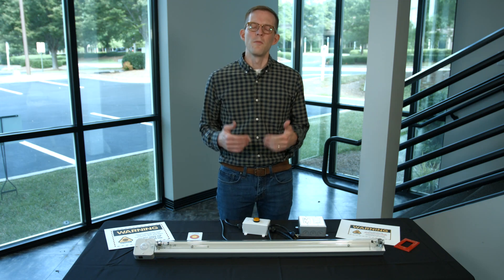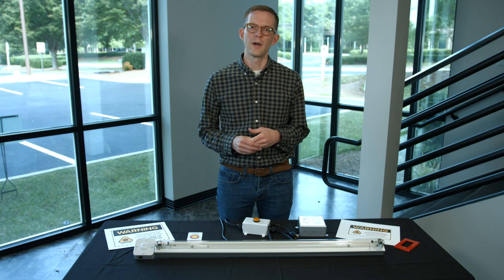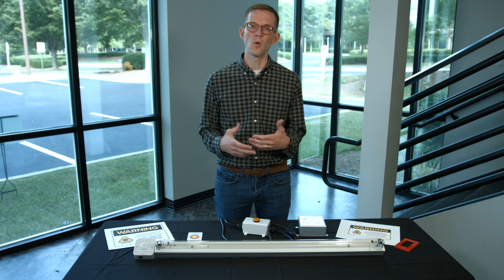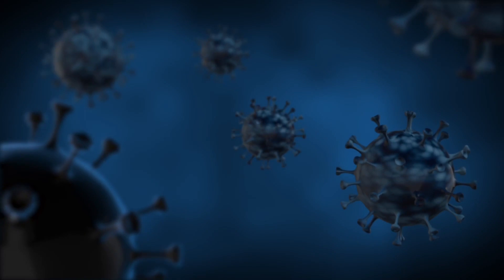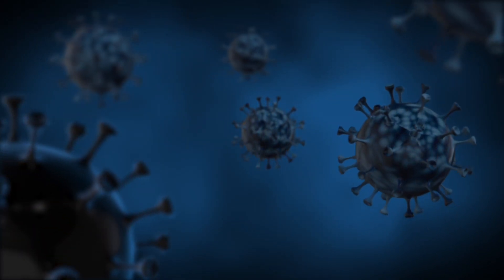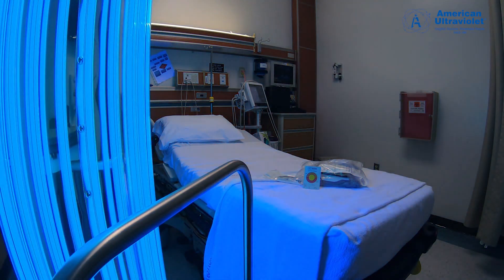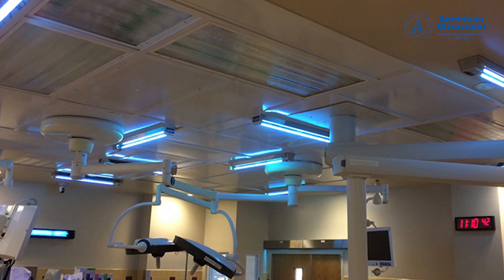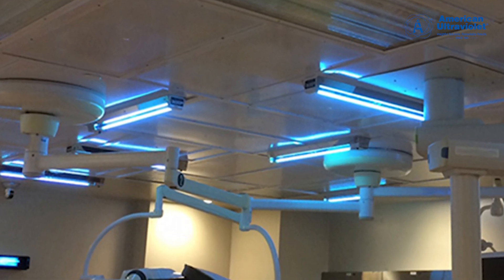Today I'd like to talk about best practices for safely using germicidal ultraviolet light to disinfect spaces or surfaces. This is a fantastic tool for deactivating viruses or other pathogens, and industries like healthcare and hospitals have been using this technology for many years. It's a proven way to disinfect surfaces and areas, but it also carries some very important safety considerations.